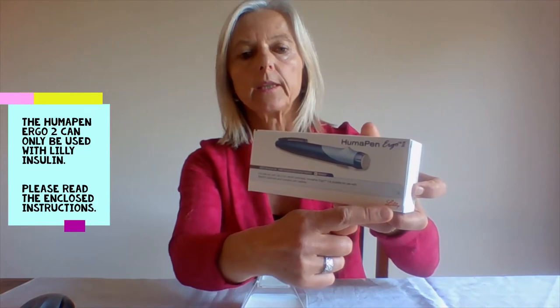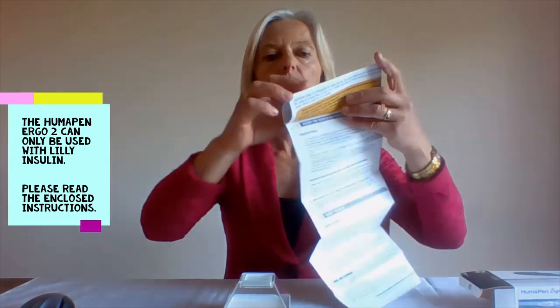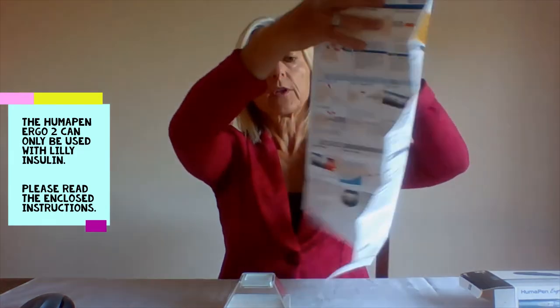Please be aware that this pen can only be used for Lilly insulin. When you open the box you will find an instruction leaflet. Please read it carefully as it contains important information and instructions.